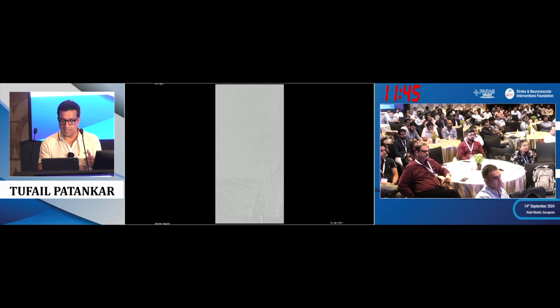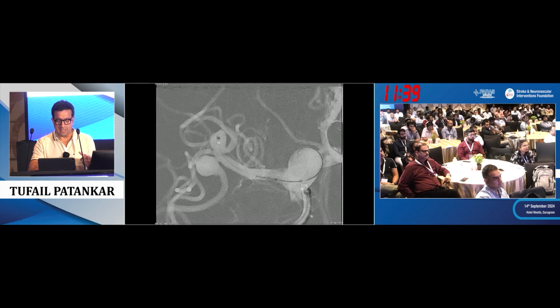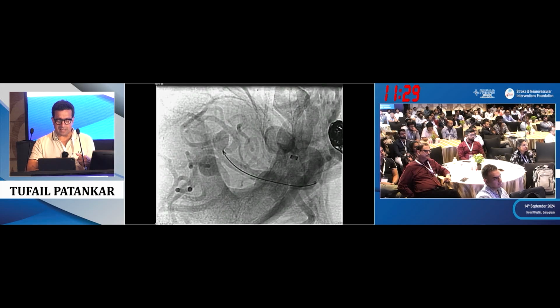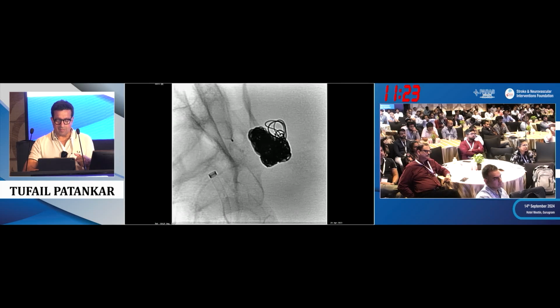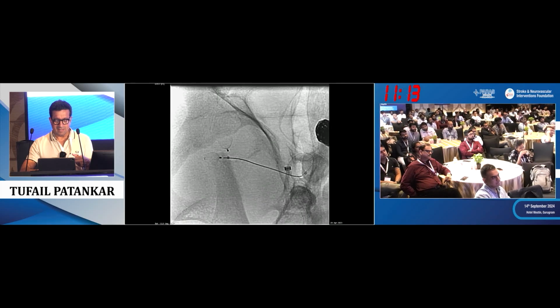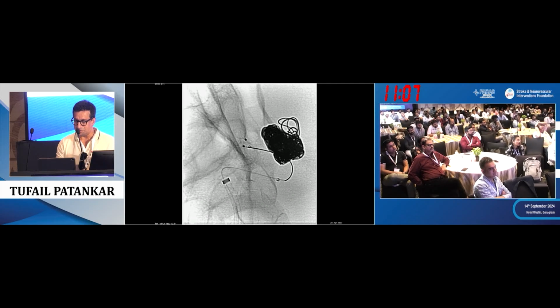And then the CT. Again, in another video here, you can see the device has been pushed on this side, and you can see the opening. You can play. You can then bring it back. You got another aneurysm here. This is Vipul's case. And you can see now he's gone in. Obviously this patient has a lot of money. So you can see now, you can put another contour, and you got two kissing contours there. So you can see, and you got a stent in the middle, but two kissing contours.